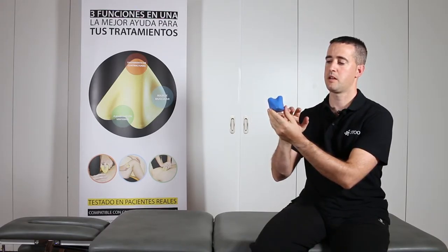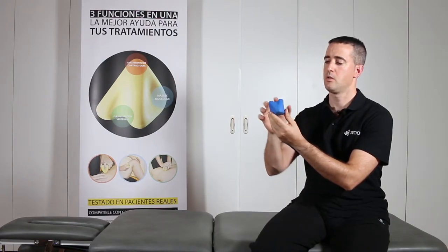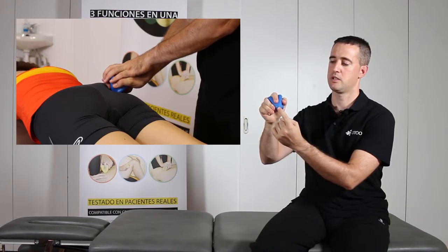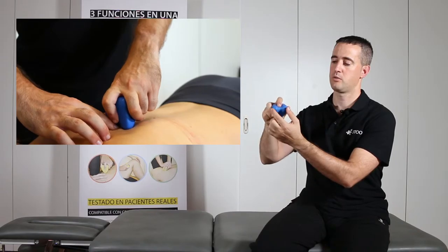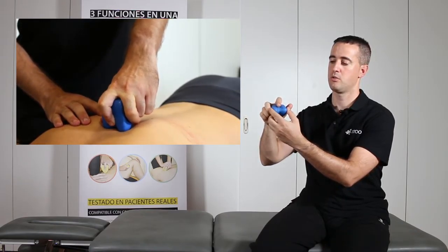3Tool has three different treatment areas which provide three very different kinds of grips. The first grip will allow one to apply pressure over trigger points. If we modify the position by slightly rotating the tool, it will enable physiotherapists to carry out applications of the paravertebral muscles or mobilization of vertebral segments.